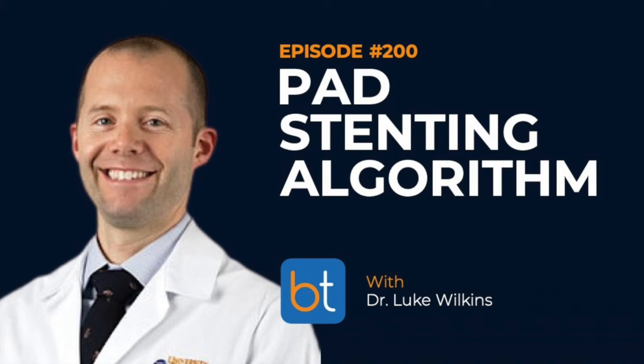Okay. I'd like to go back to the part about vessels less than 5 millimeters. I see some advanced intervention after IVUS is indicated. Could you tell me a little more about your experience with these? Yeah, so that's the made-up part of the algorithm. When there's less than 5 millimeters, your choices are a little more limited, and these are the more challenging vessels to treat. Some of the interwoven stents come in smaller diameters for these smaller vessels, and I think those do very well in patients that have smaller fempop segments.